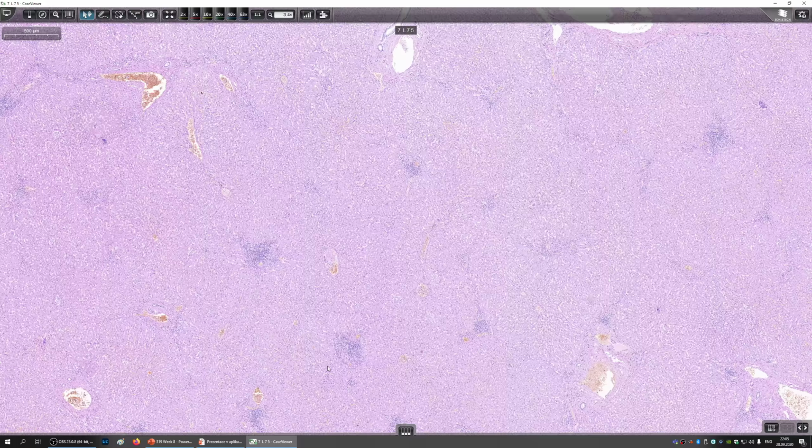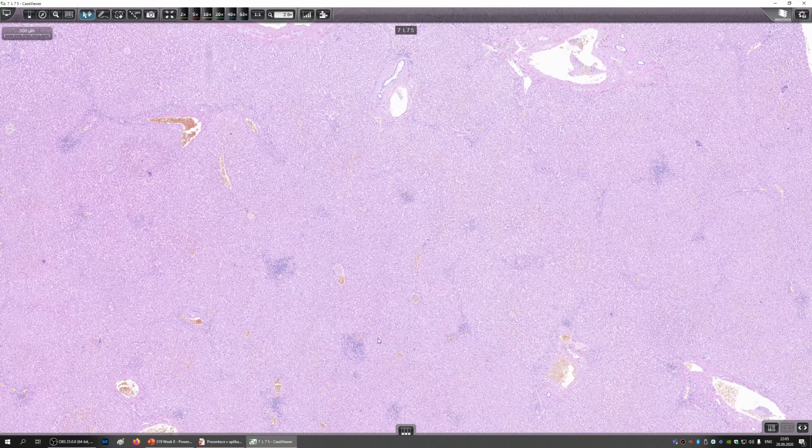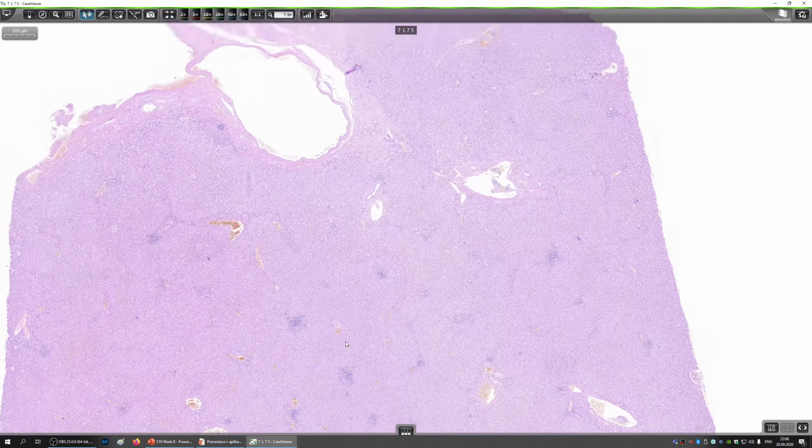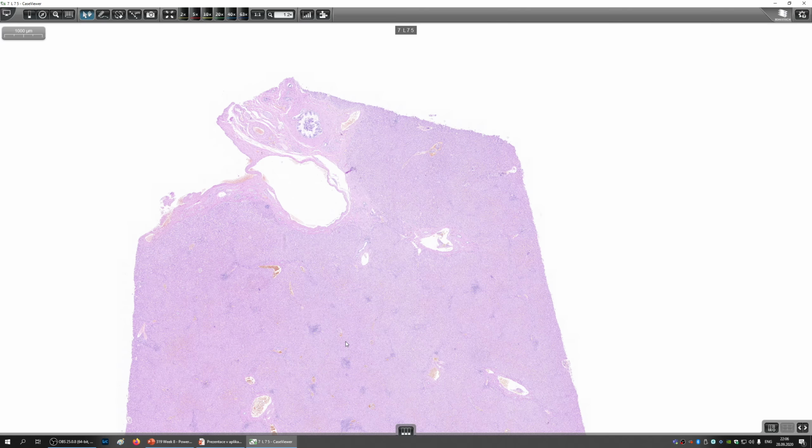As you can see, these findings are a bit mild on the first look, but they are quite serious. So we would expect this person to have elevated liver enzymes, elevated hepatitis C count. Hepatitis C RNA is elevated. I think it's measured like that. RNA is measured. And then this person could also have cholestasis and other signs of liver failure.